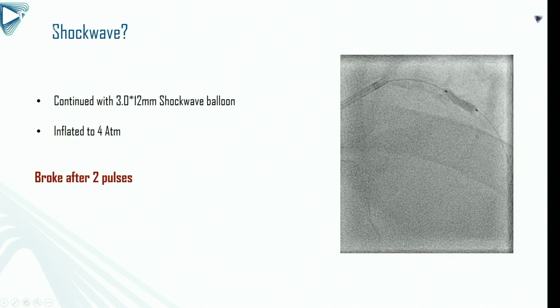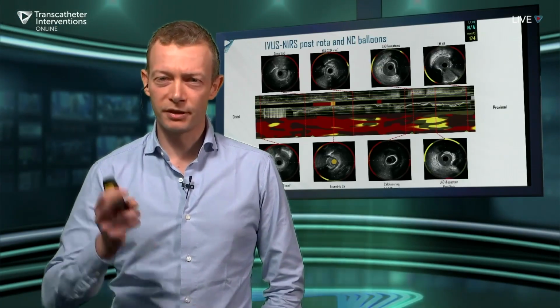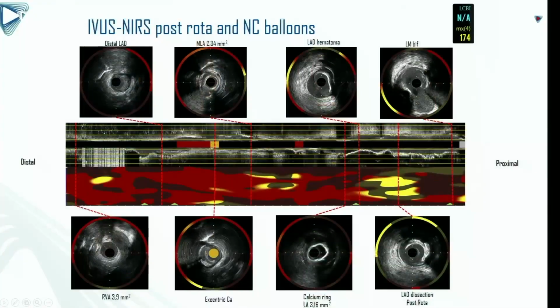So what next? I want to show you this case because here also with IVUS you can very nicely appreciate all the things that you can do, or that we did in this case, to torture this vessel.